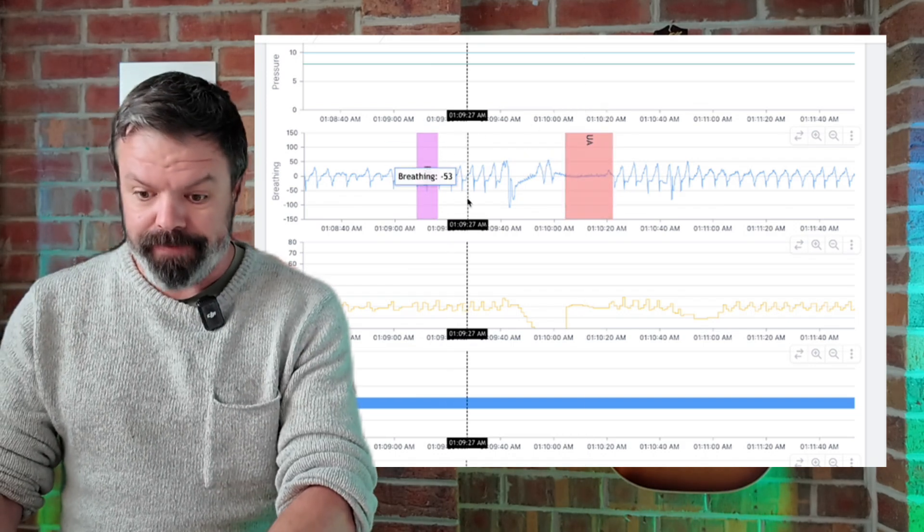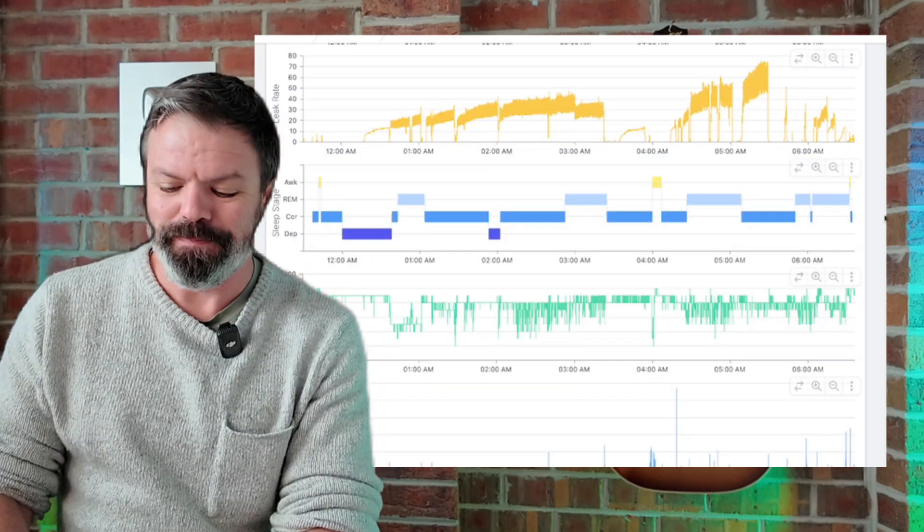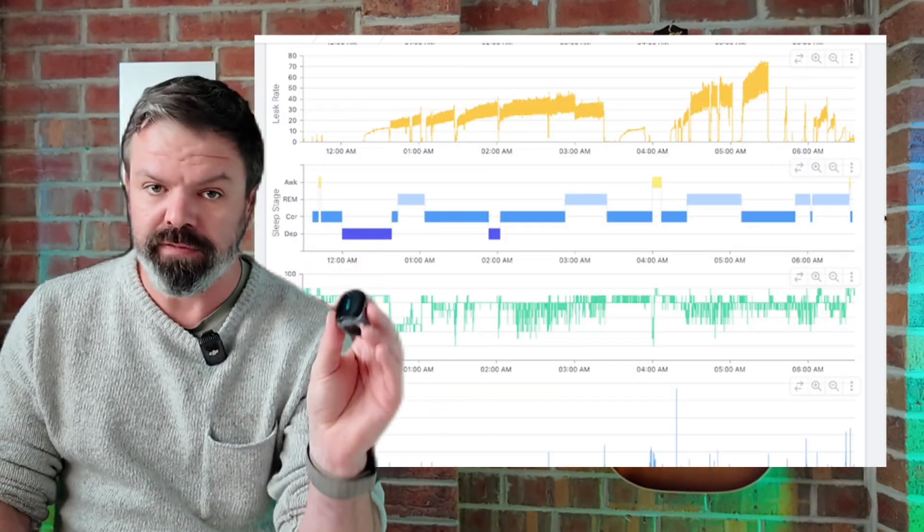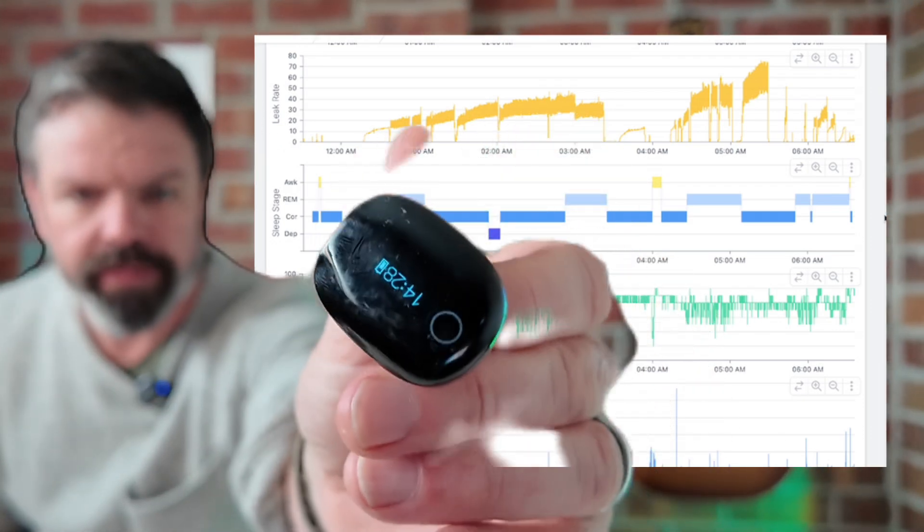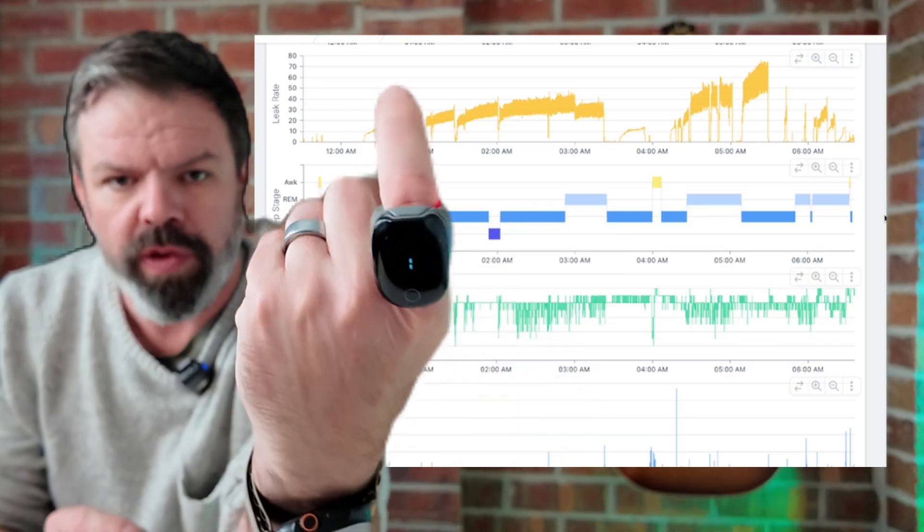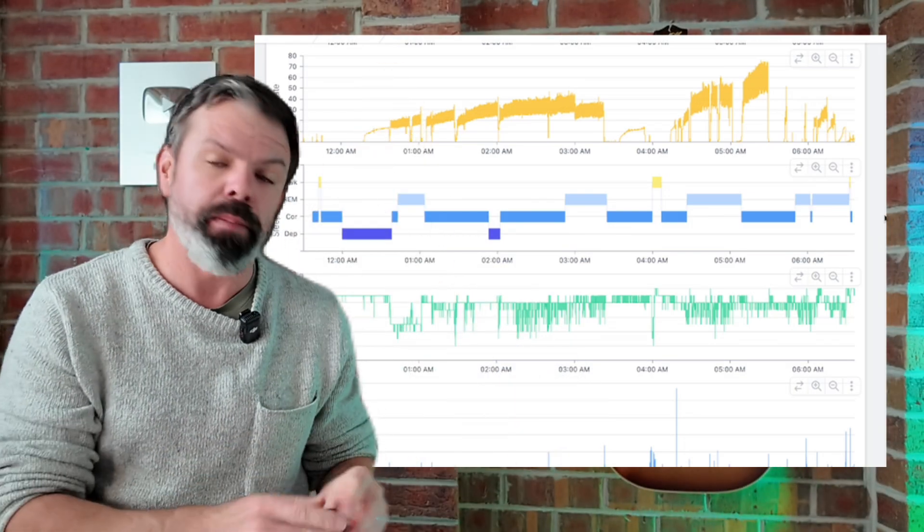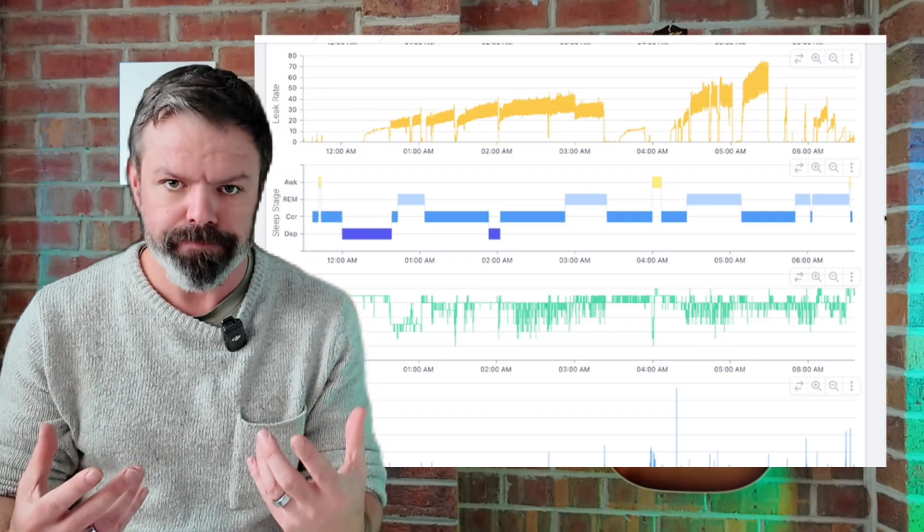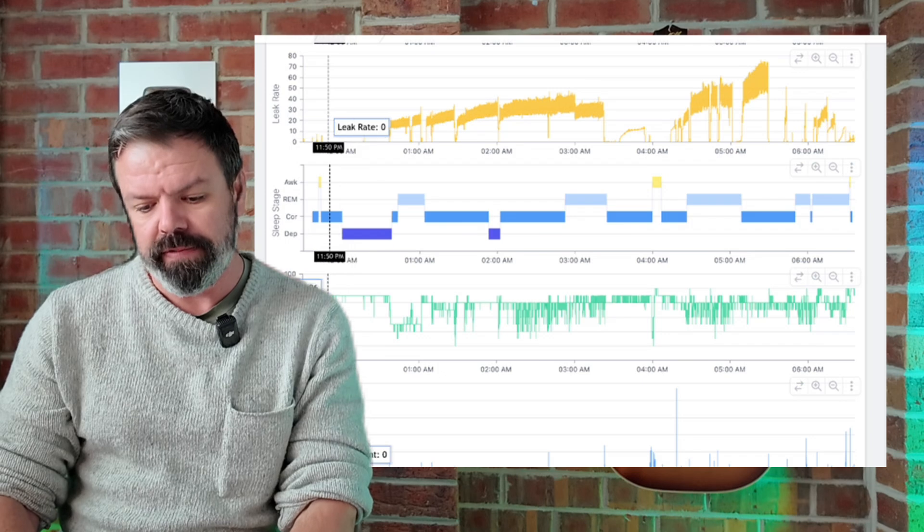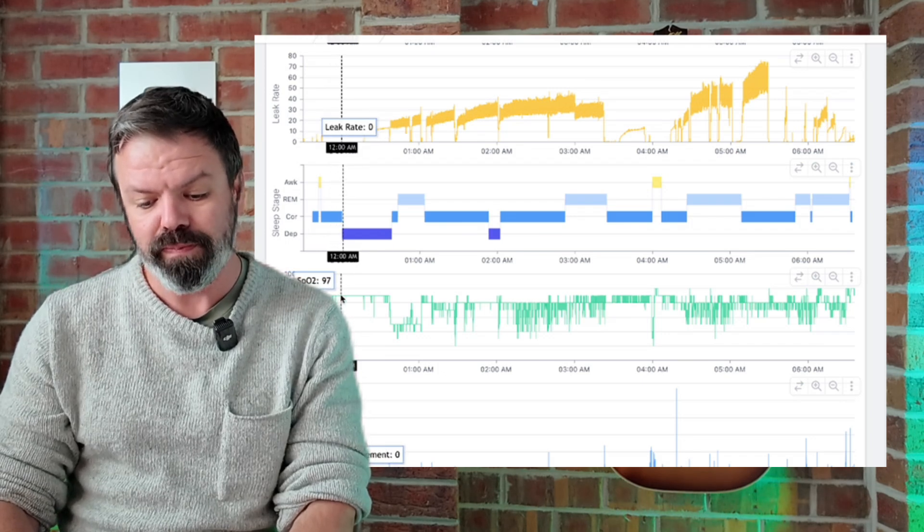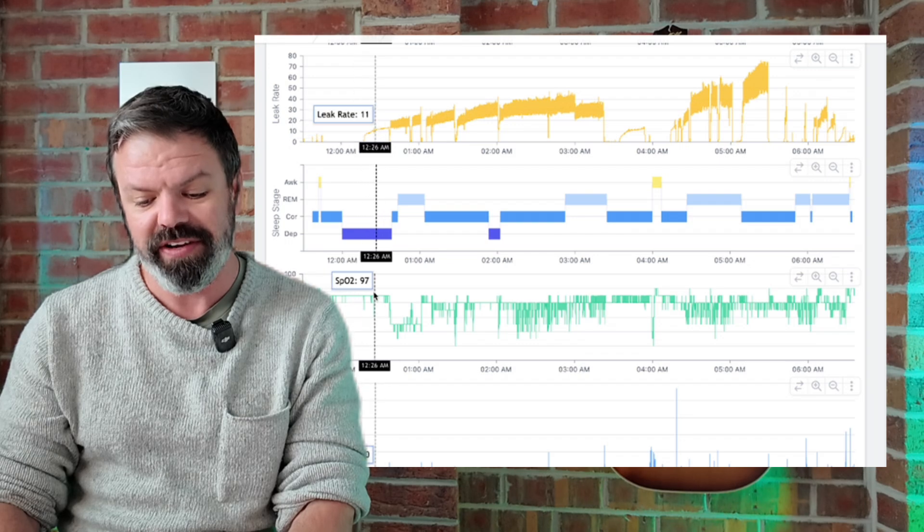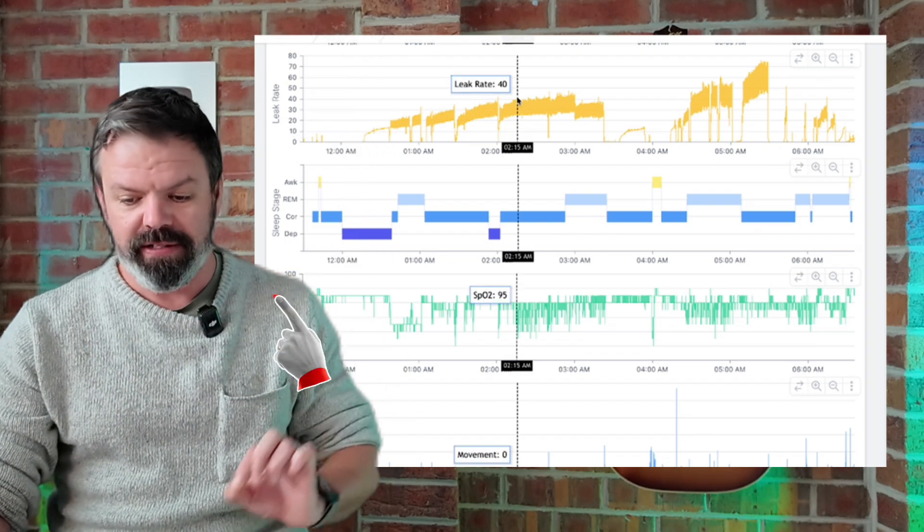Now I also want to show you something else here. This patient is also tracking their blood oxygen levels with a Sleep HQ O2 ring. They put it on their finger or thumb when they go to bed, and it measures their blood oxygen levels every second, their pulse rate and their movement. And have a look here. When leak is at zero, look at the blood oxygen levels: 97, 97, 97. It's a nice stable flat line.